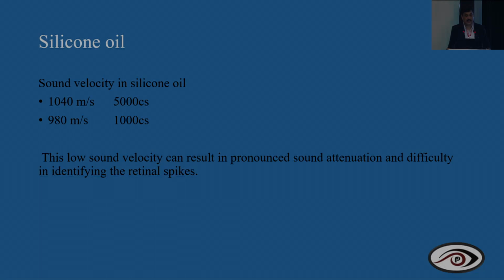Normally with silicone oil, as I said, the low sound velocity can sometimes give the wrong reading, so you have to keep the setting at a much lower level.